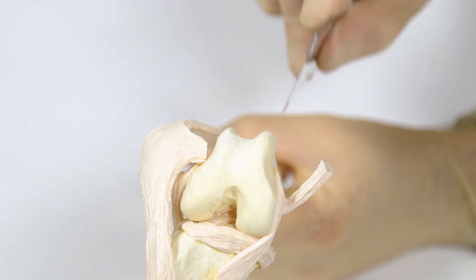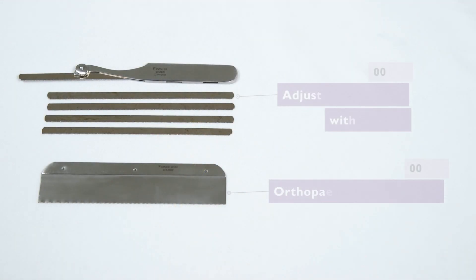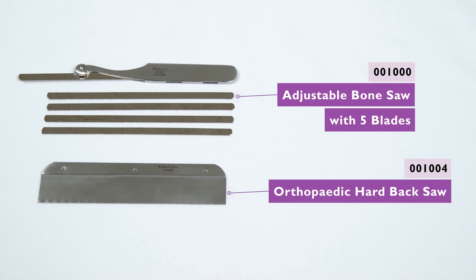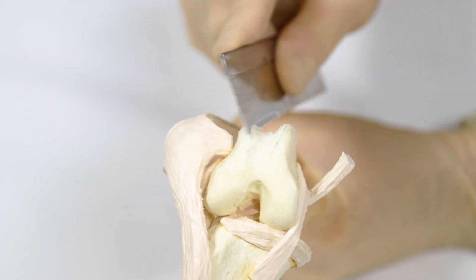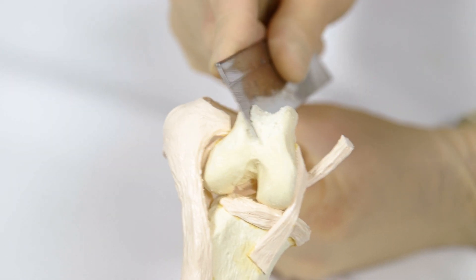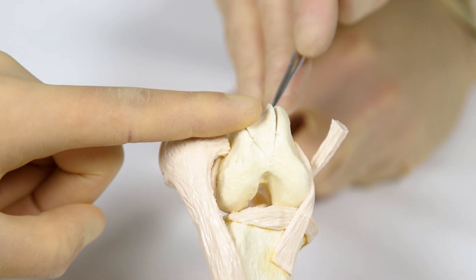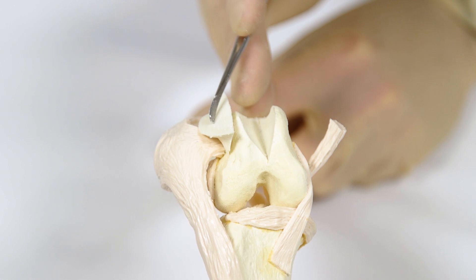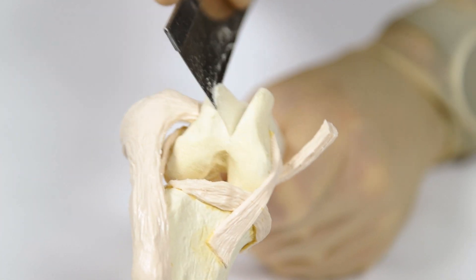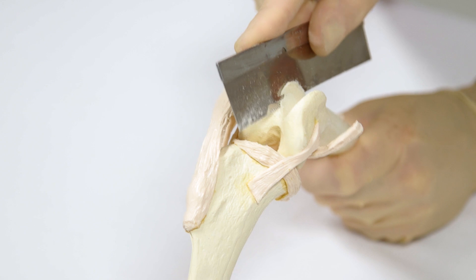A number 11 scalpel blade is used to score the highest points of the medial and lateral trochlear ridges. The score marks are used as a guide for creating an osteochondral wedge using a fine-toothed hand saw. The lateral and medial saw cuts should be oriented obliquely to meet just cranial to the intercondylar notch of the femur distally and at the osteochondral junction proximally. Once the cuts are completed, the osteochondral wedge is carefully removed from the femur. Recessing the wedge is usually achieved by making a further cut to remove more bone from either the medial or lateral exposed trochlear sulcus.